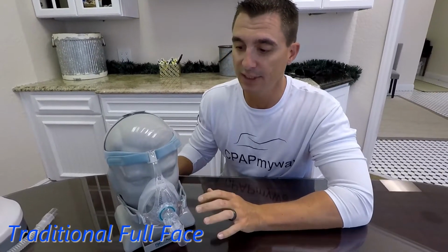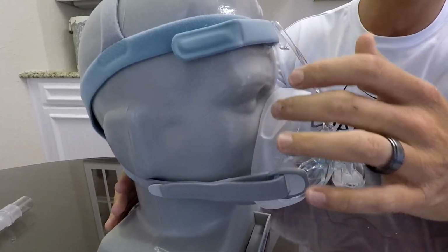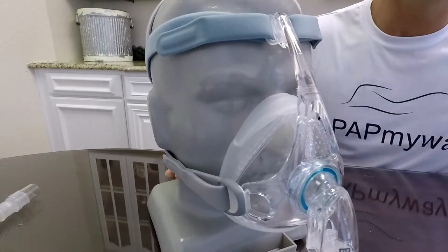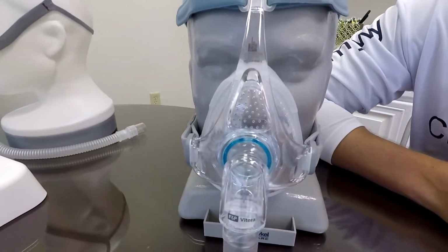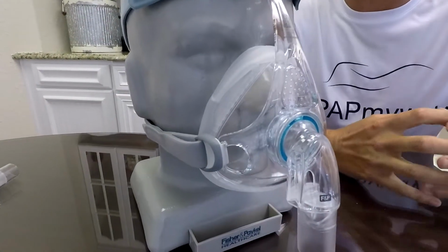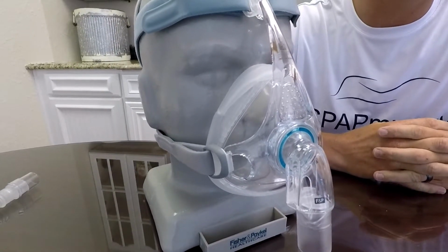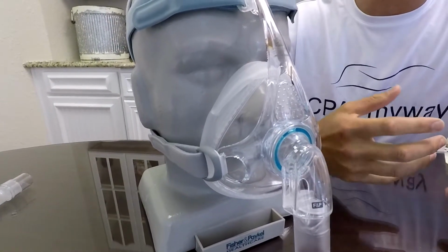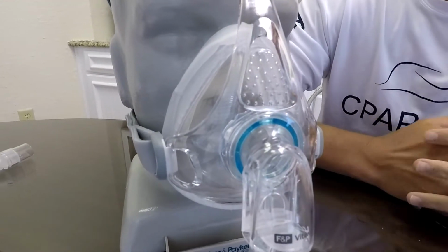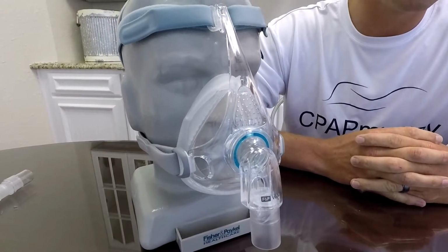Next up is the traditional full face style. We're going to define traditional as it goes over top of the bridge of the nose and over top of the mouth. This is one of those that pretty much works every time because you can breathe through your mouth or your nose. It's obviously a good bit more on the face, but it's a good go-to for people that just want to get the job done. We've had a lot of people tell us that it has a little bit more of a natural breathing feeling because you're free to breathe through your mouth and your nose at the same time, or either or.